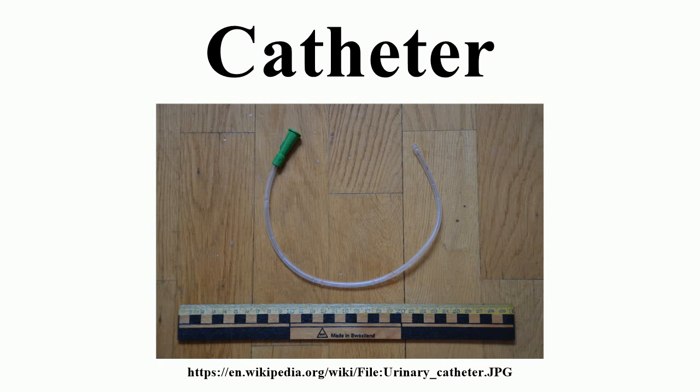Angioplasty, angiography, balloon septostomy, balloon sinuplasty, cardiac electrophysiology testing, catheter ablation. Often the Seldinger technique is used. Direct measurement of blood pressure in an artery or vein. Direct measurement of intracranial pressure. Administration of oxygen, volatile anesthetic agents, and other breathing gases into the lungs using a tracheal tube. Subcutaneous administration of insulin or other medications, with the use of an infusion set and insulin pump.